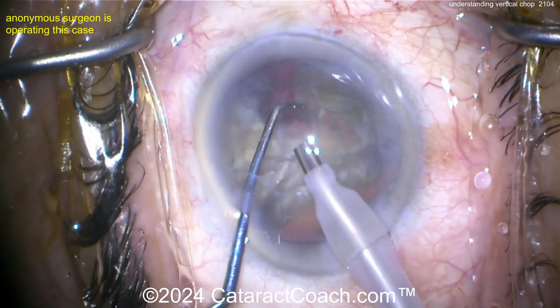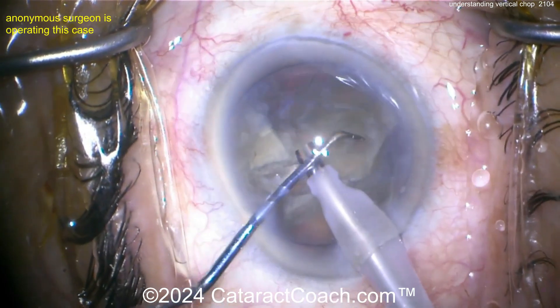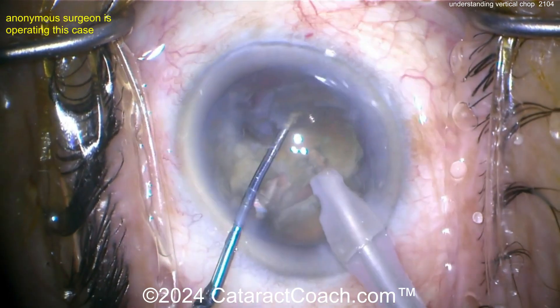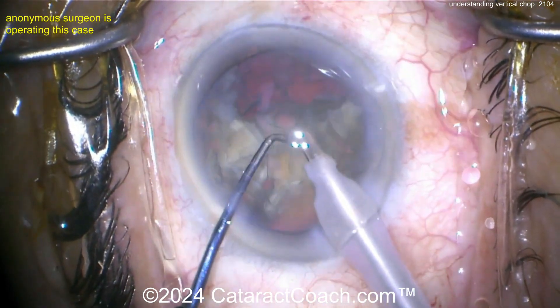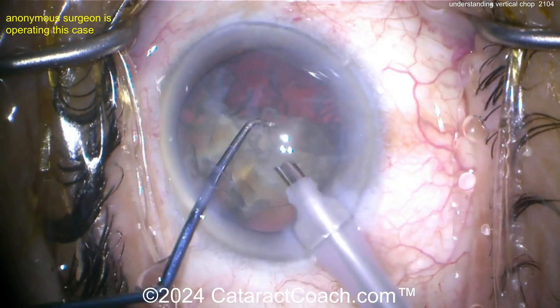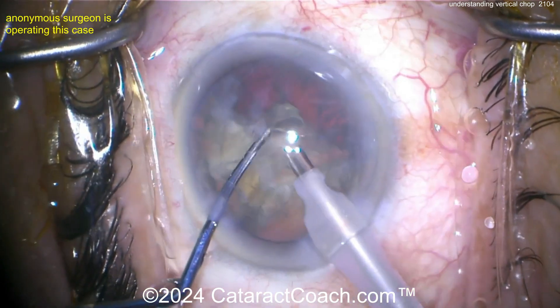The nice advantage here is you don't need to go underneath the rexis edge and you don't have to go all the way to the capsular bag equator. You can stay within the central nucleus and within your capsular rexis. That makes it a hugely important difference and makes it easier to learn.